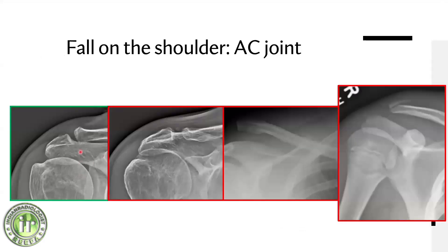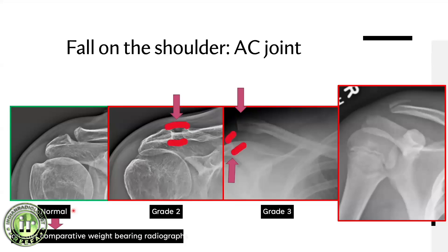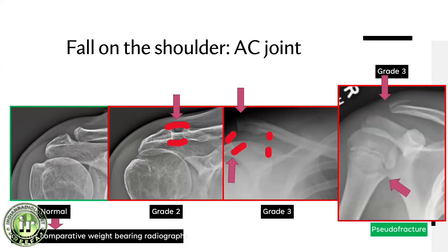Here are the AC joint grades: the normal AC joint shows no widening. When you see widening without load bearing, the AC joint capsule has ruptured - that's grade 2. In grade 3, both the superior and inferior capsule of the AC joint have ruptured, and additionally the coracoclavicular ligament ruptures, causing superior migration of the clavicle. Grading systems go up to six, but these three are the most important. Occasionally you'll see AC separation with a bony avulsion from the distal clavicle.